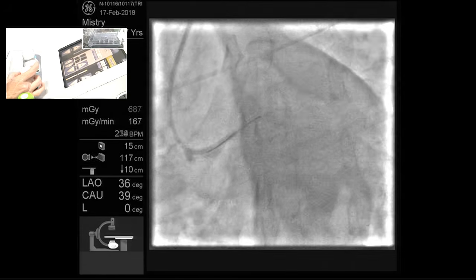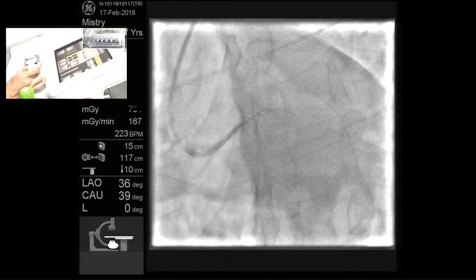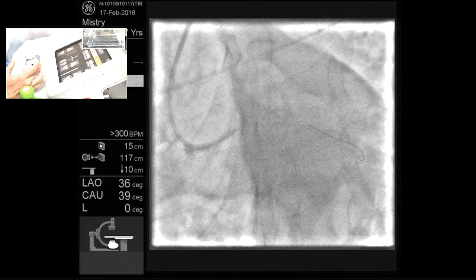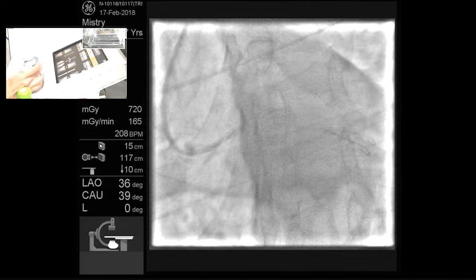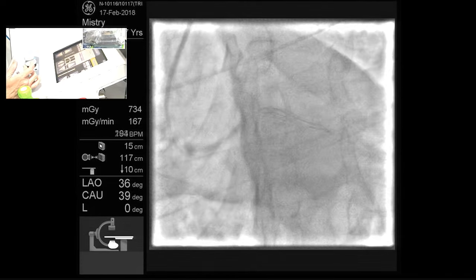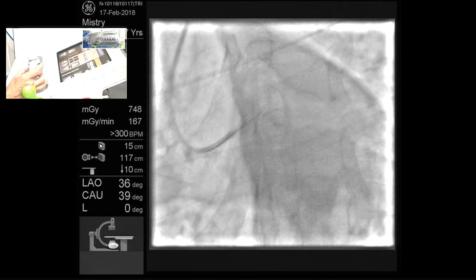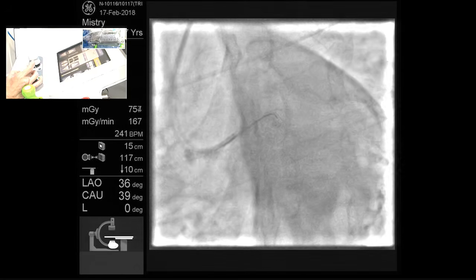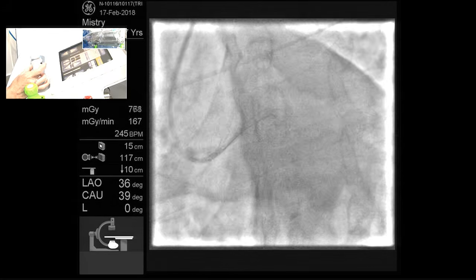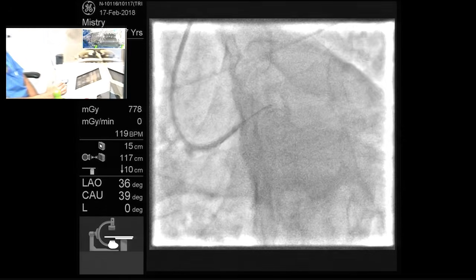Sanjay, you might have to give the curve. We can deform the wire. Yes, that is right. Okay, this is good. The wire is not getting deformed. I want to deform the wire. I think last chance I am taking and then we give the curve.